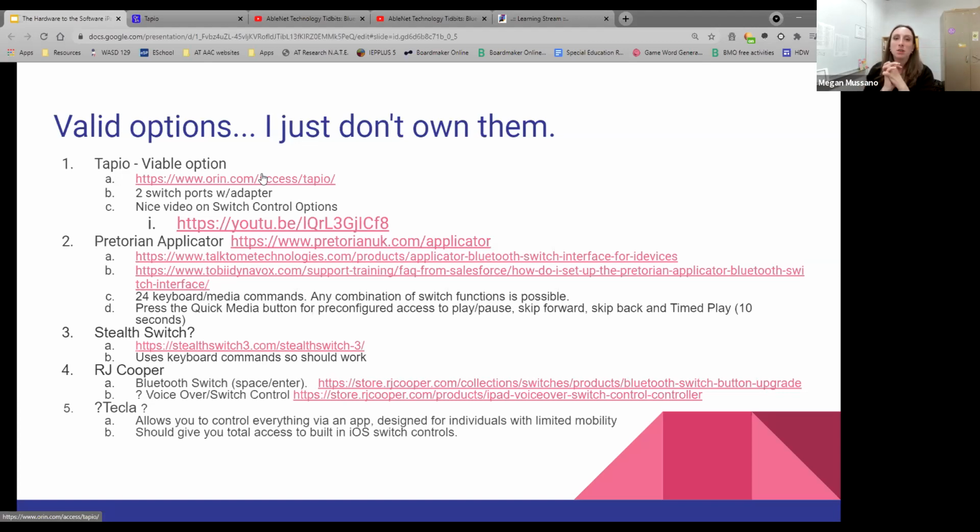That's actually something that I'm going to talk a whole lot about in our next session, because we can create custom gestures. We can make overlays, create custom gestures that align with just about any app. We can make those apps interactive. But then what's really exciting is we can program a custom recipe in the iPad, where when we hit a switch, it does a series of custom gestures or a series of different things at the same time. And that's what really makes the iPads accessible. So I just wanted to give you a little taste of some of the options to come.